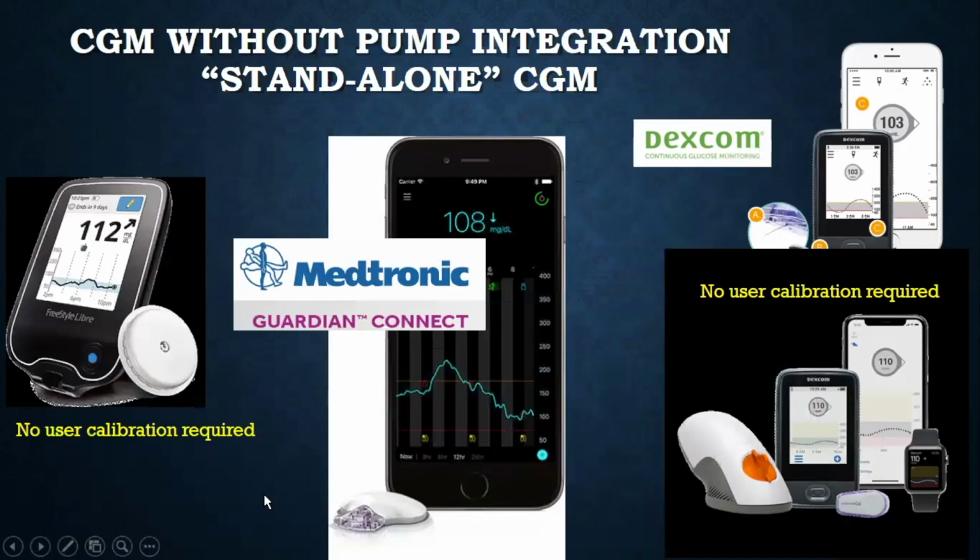Contrasting to that, there are other systems, including the new Medtronic Guardian Connect, which you see the sensor here. It continuously monitors the blood sugar and interfaces with a program on the phone, which does set off alarms if the patient is headed towards a low blood sugar, high blood sugar, or the rate of their glucose is changing too quickly.